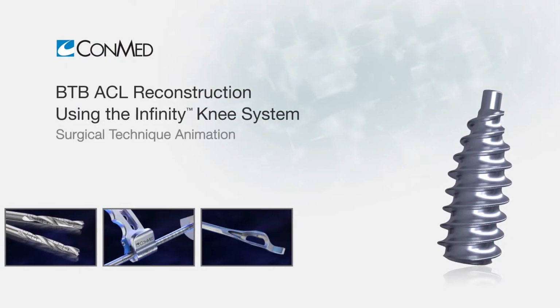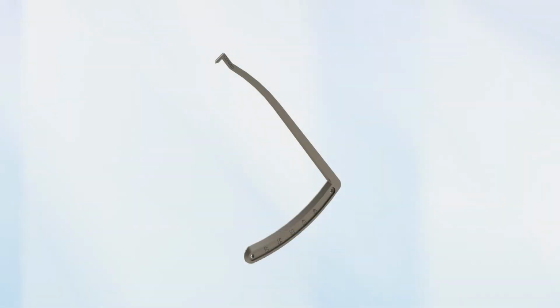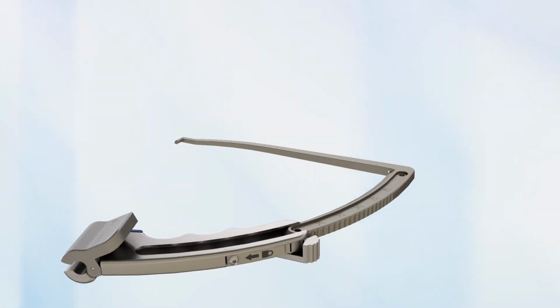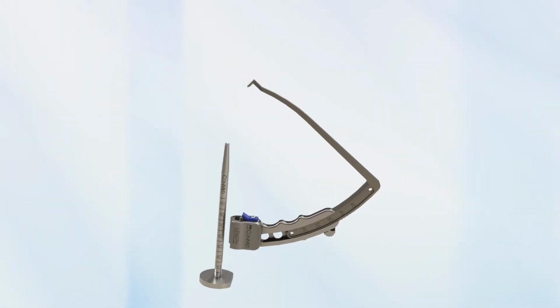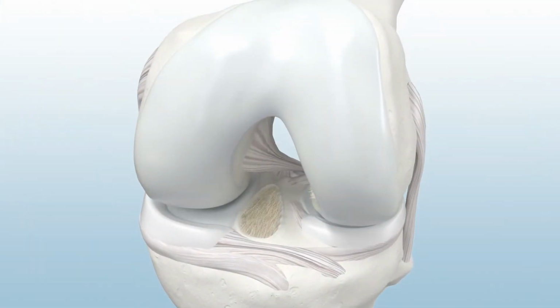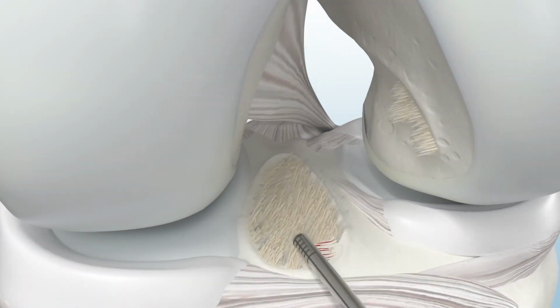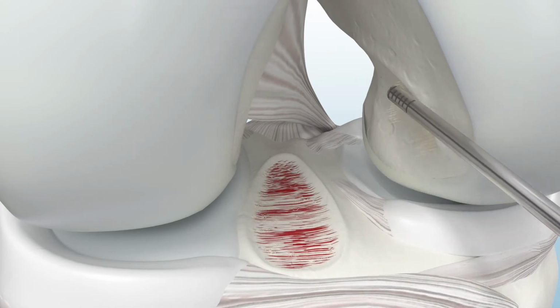The Infinity Knee System is a modular platform for ACL reconstruction that supports a variety of surgical approaches, reaming, and fixation preferences for both soft tissue and bone tendon bone fixation. To begin, debride unwanted remnant ACL tissue and mark the center of the desired ACL tunnel position.